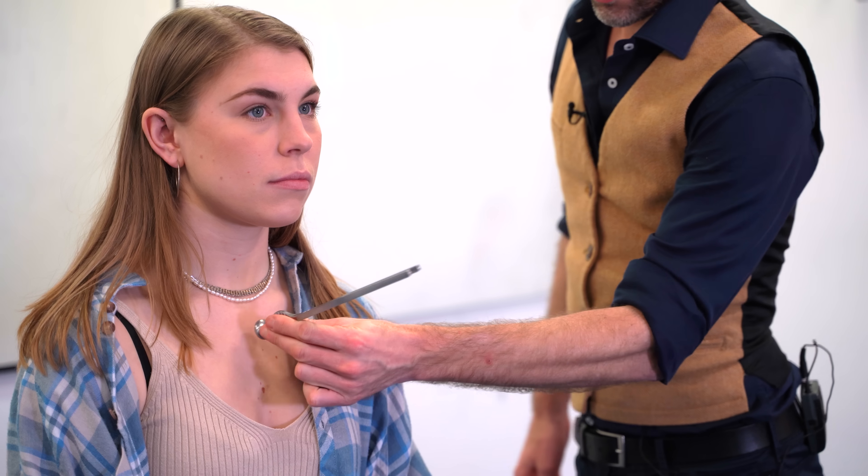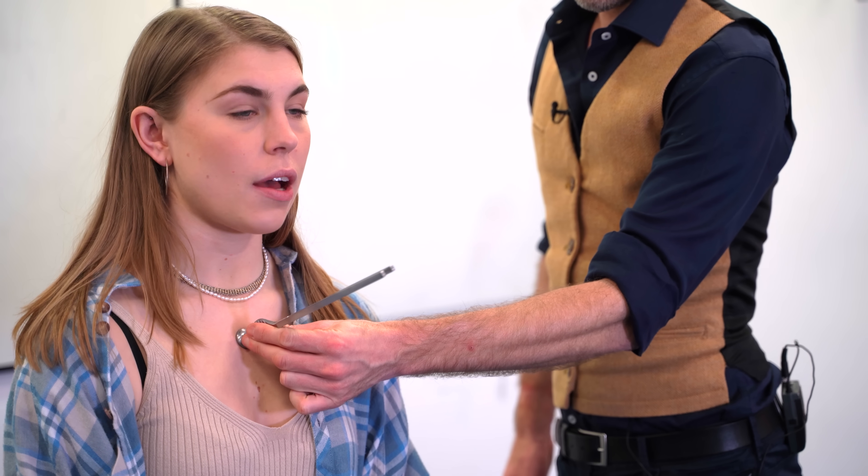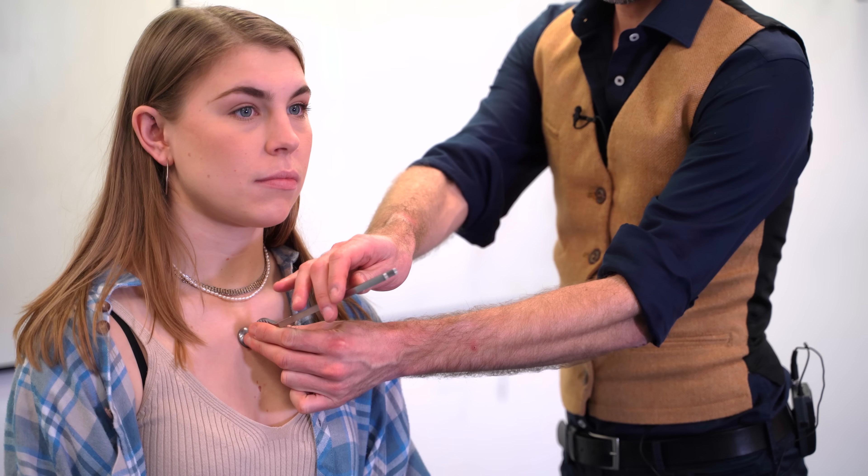I'd like to use this tuning fork to see if you can feel the vibration sense. I'm going to strike the tuning fork and place it on your chest. Can you feel the vibration there? Yeah. Tell me when it stops. So we can see the difference between the two — this forms the basis of the test that we'll apply to the peripheries.